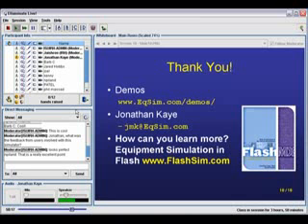And what you'll find is that they'll do well in certain things and not so well in others, and that'll give you the area to focus on in terms of the actual simulation, or the more interactive pieces. I say simulation, but it's really just more interactive pieces. It really gives you that focus, because you know which skills you're looking at, and you know what types of things are not adequately handled by more static representations.